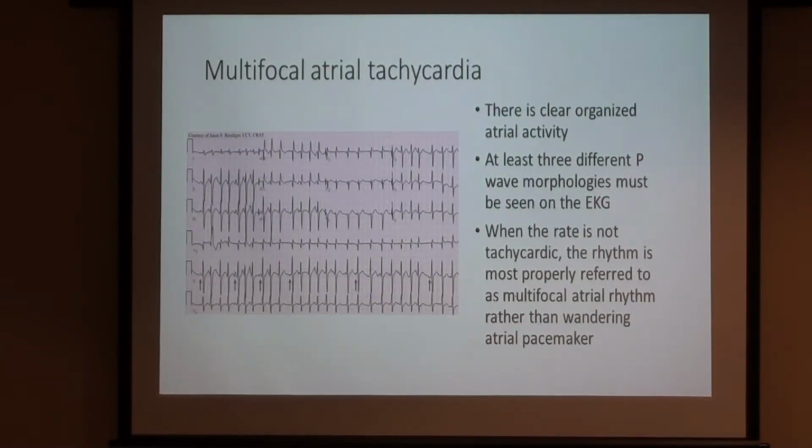So this is an example of an atrial tachycardia not of sinus origin. A typical atrial tachycardia is one where there's one focus and it's just ripping along. But this is one that, I got to tell you, is probably missed more than anything else.